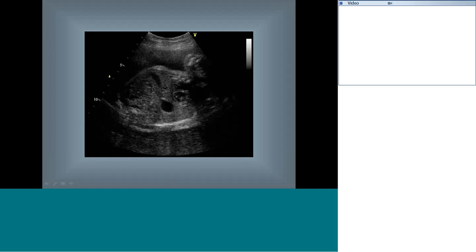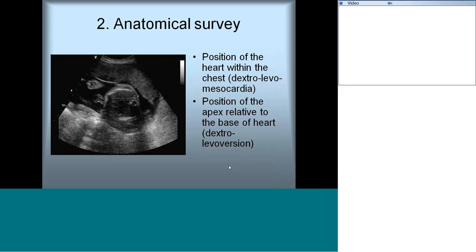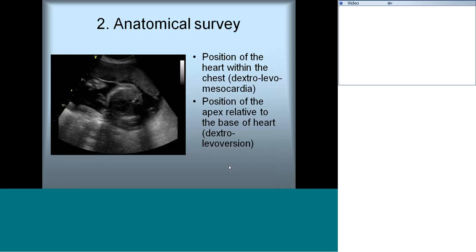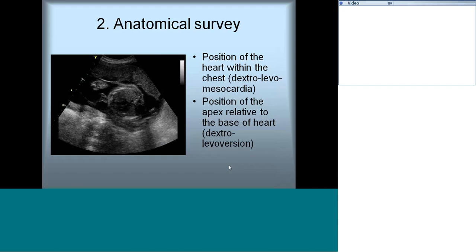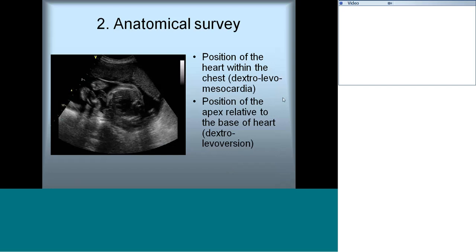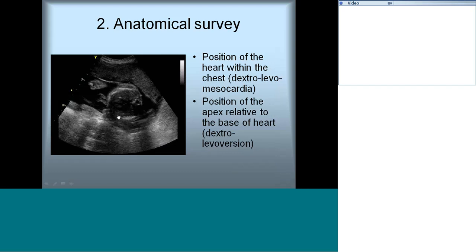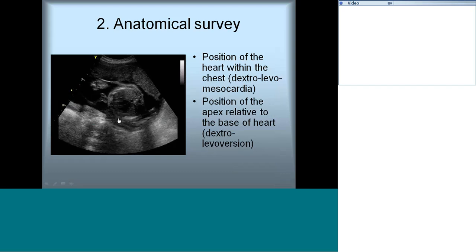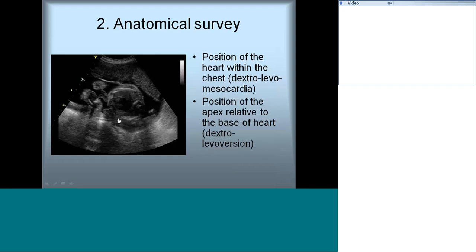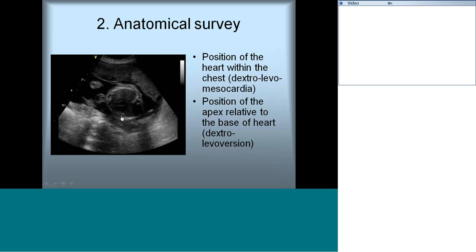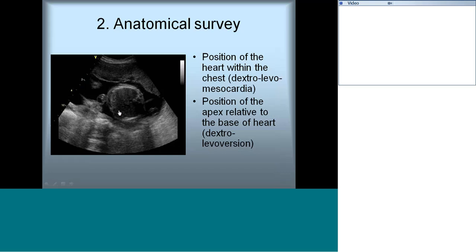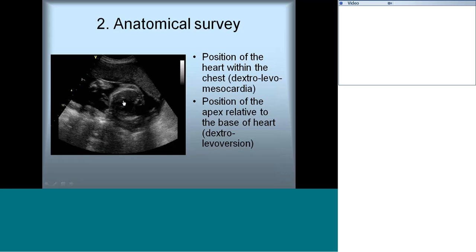Now that we know right from left, we start our detailed anatomic survey. Make sure the position of the heart is correct — the heart could sometimes be ectopic, lying within the chest on the right side, left side, or midline. Also important is the position of the apex of the heart — whether it is facing the right side or left side of the chest.